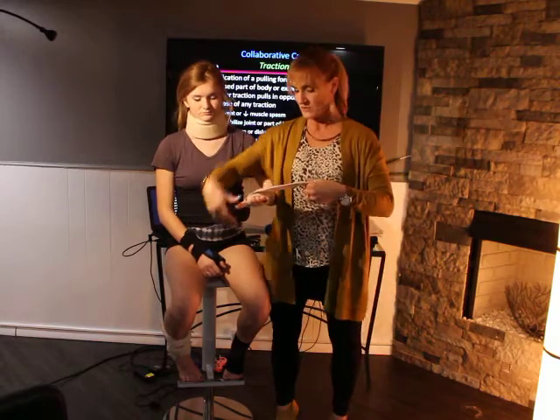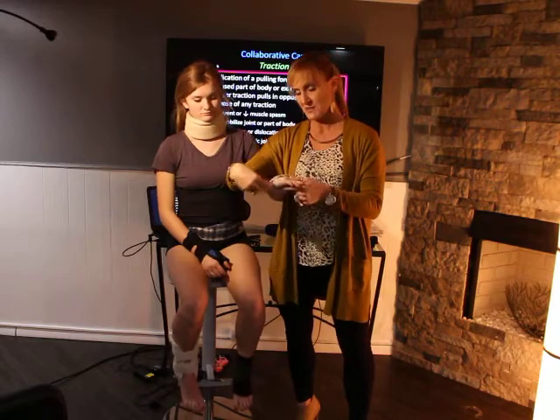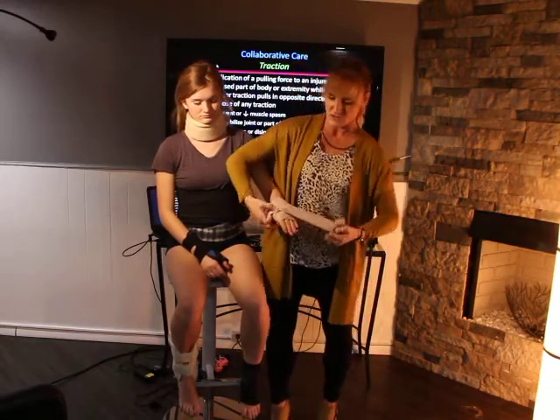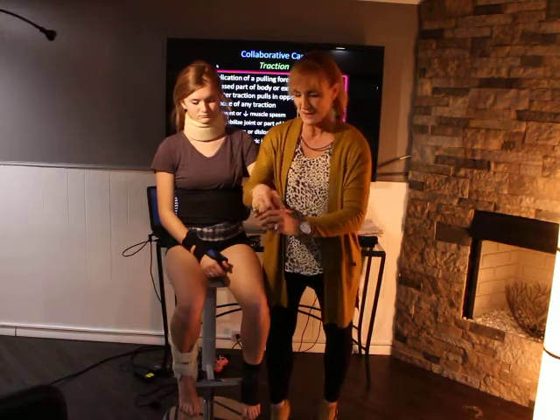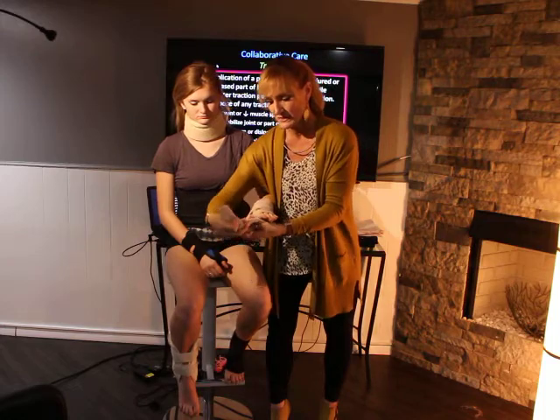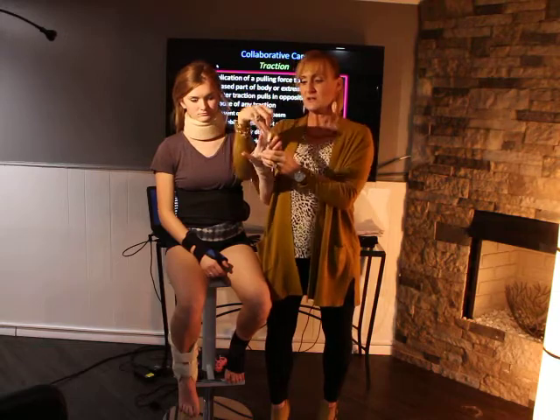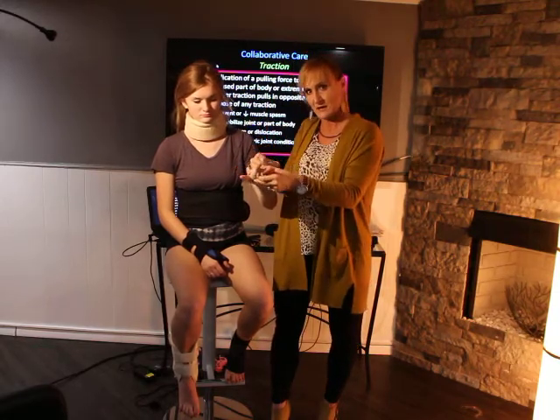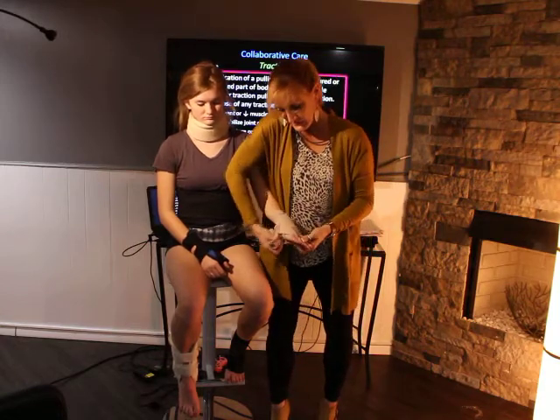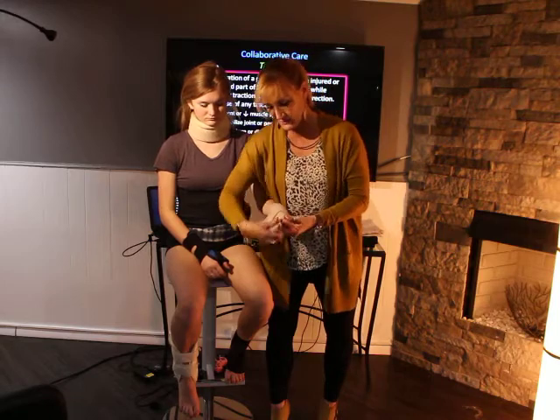Another thing, let me show you a little trick you can do with an ACE wrap. So let's say this person has a sprained thumb and a finger. Let's say I want to go between the finger. So you can go around here, and then you can almost fold your ACE wrap. See? Hold up. So see, you can fold it, go in here, because now I'm going into like a smaller little area like that. You're going to go back down around the thumb, then you can open your ACE wrap back up. Go back down around the thumb.